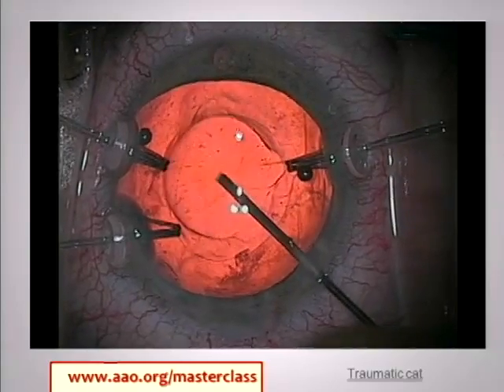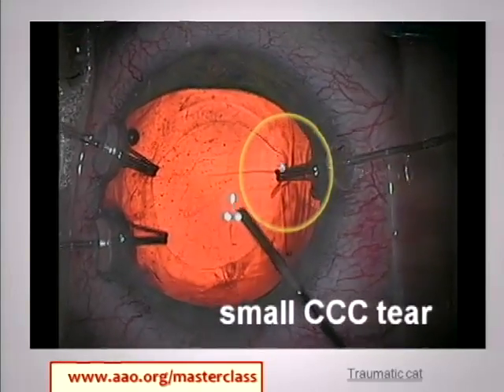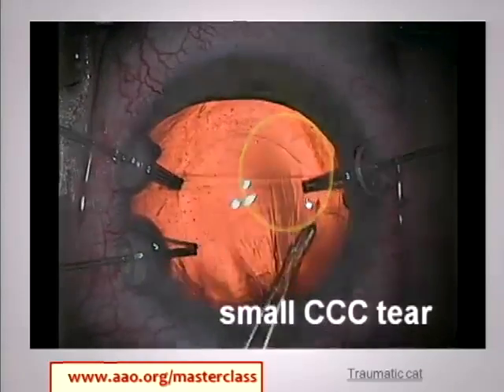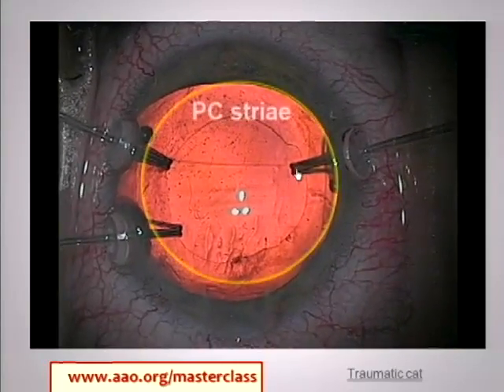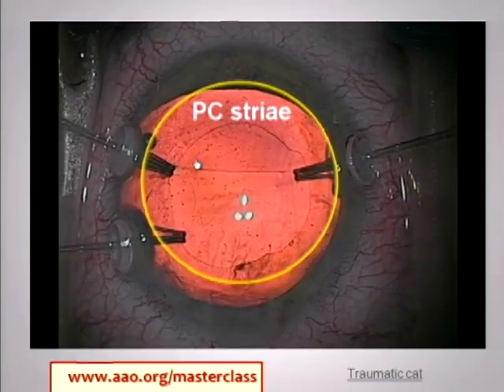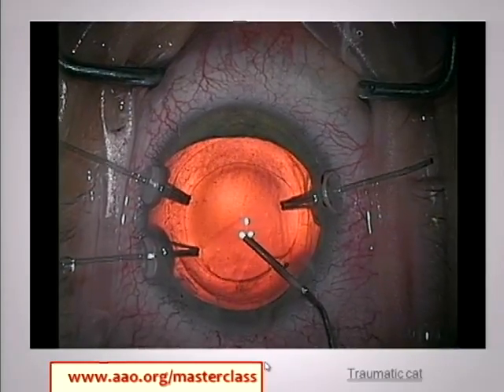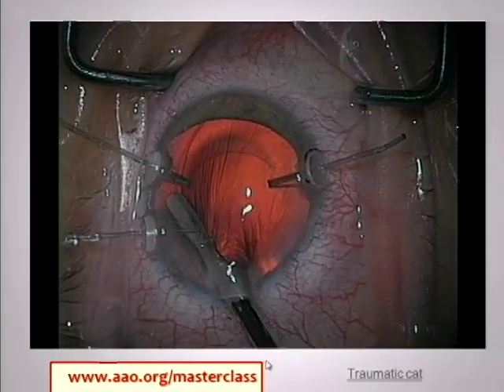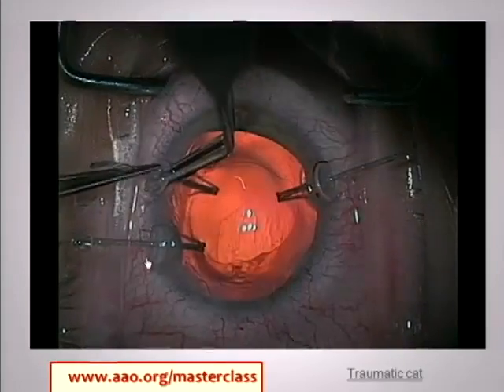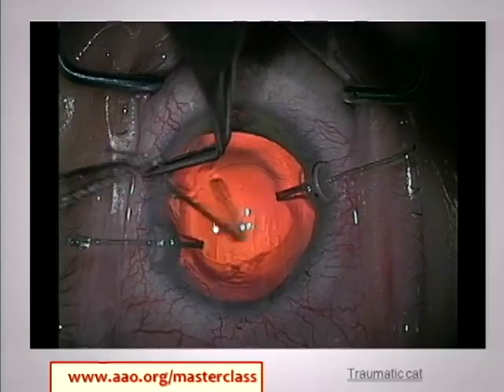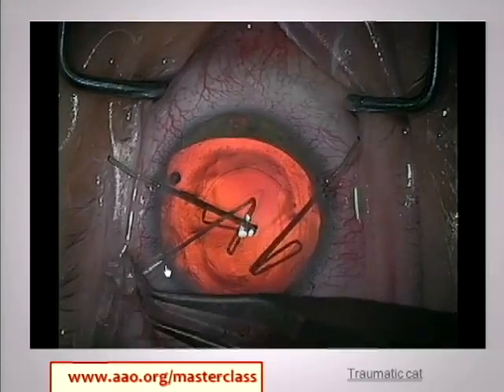Now I'm going to put in the capsule tension ring. I see there actually is a tiny little tear, and I think this is probably where the double barrel helped me from having this go out too far. If they're too tight, you'll split the capsule. Before I put the CTR in, I look very carefully for any stria in the posterior capsule because that's what will get caught by the leading eyelet of the CTR. Time again to add more viscoelastic — aim that injector tip way off to the side so the ring opens with a minimum of displacement. You can see why we leave the capsule retractors in place for the CTR, because it's going to stabilize the bag.